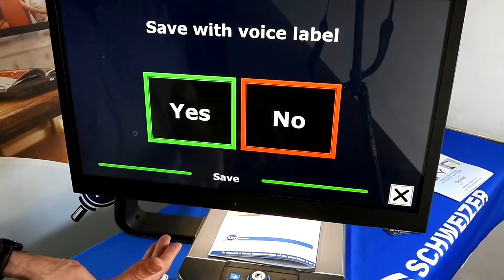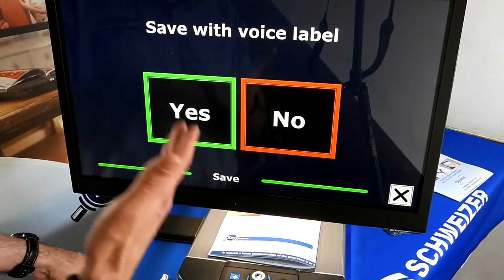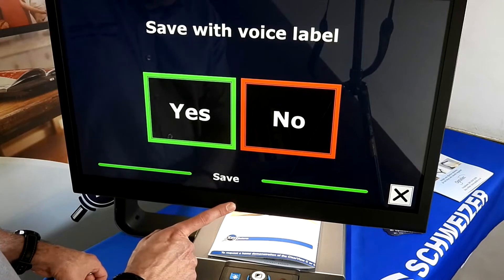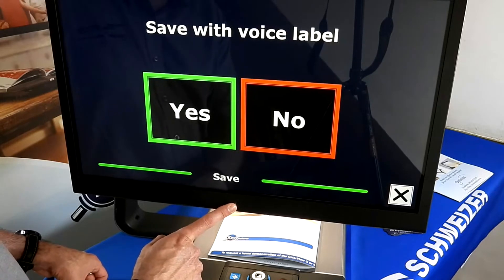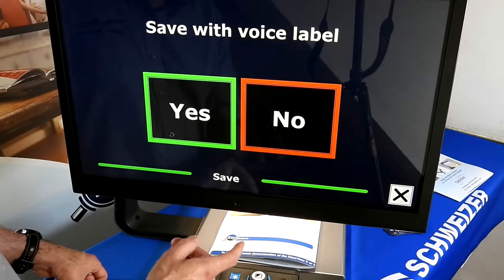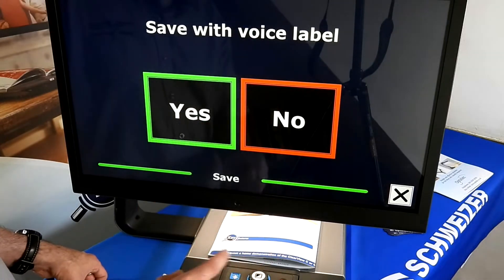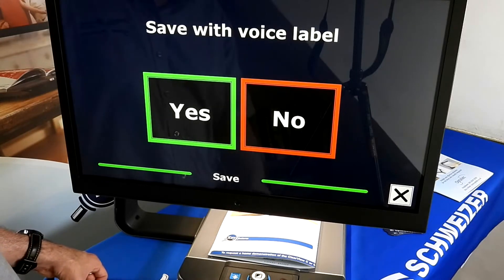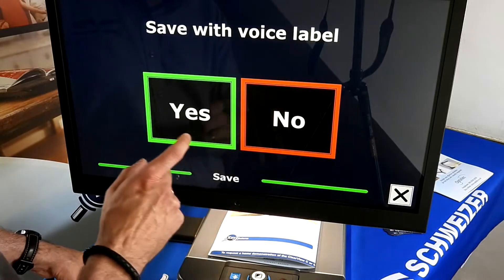You get the prompt to save with a voice label. If you click Yes, there is a built-in microphone — just where my finger is — so it'll pick up your voice and you can save it as whatever you want. If you click No, it'll just save it as the first line of text, so you still know what document you're opening later on.